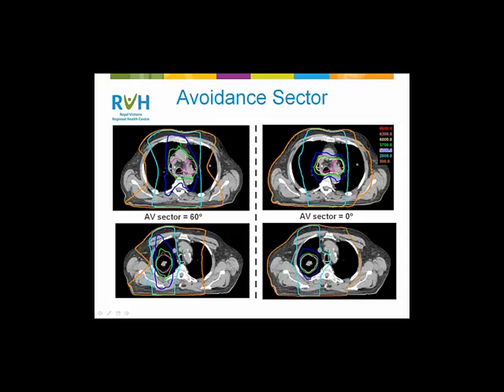Asking for constraints on the CTV drives up the complexity in planning and asks for extra objectives on the CTV, which may inadvertently increase the modulation in the beams. And I really don't think it's for any clinical benefit because we're not placing the CTV there every day. That's the whole point of having our PTV margin. I'll get off my soapbox. That's a little bit of a sore point with me, but I argue about that with my physicians all the time. Now, that said, our protocol is changing slightly.